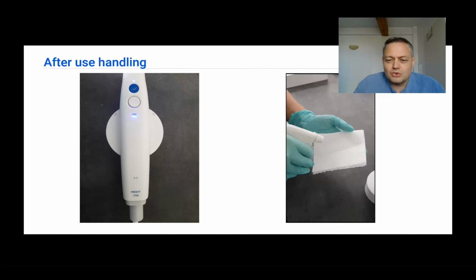So for this not to happen, the inside of the scanner is sterilized by UV means, but this only happens if you leave the scanner on after scanning, and after that the UV LED is going to disconnect. Now you know that the whole UV process is finalized.